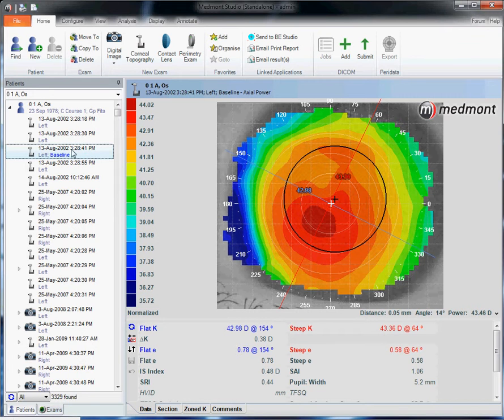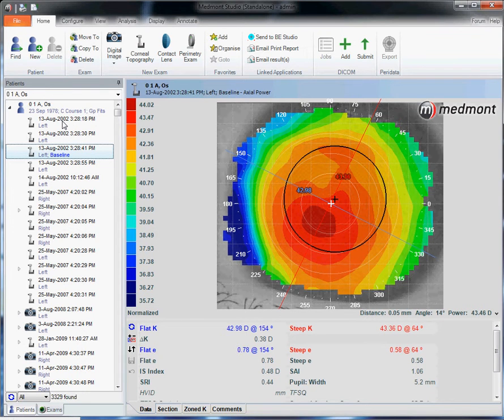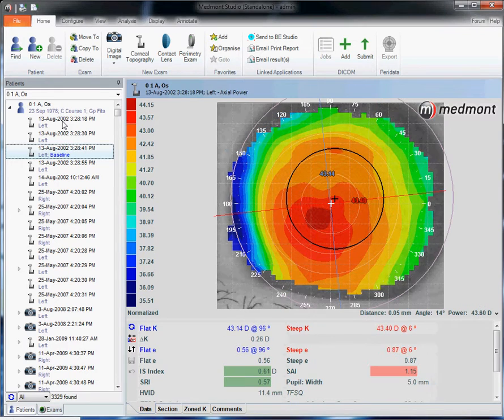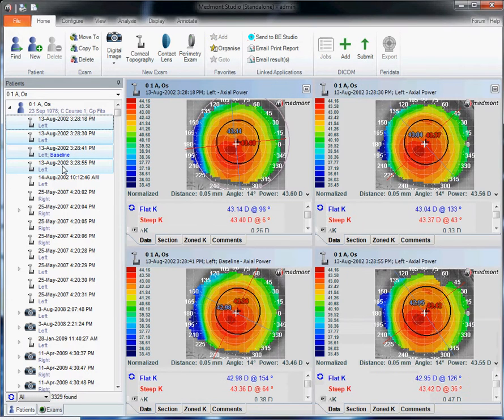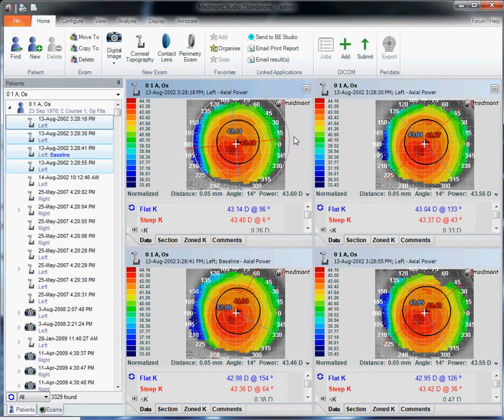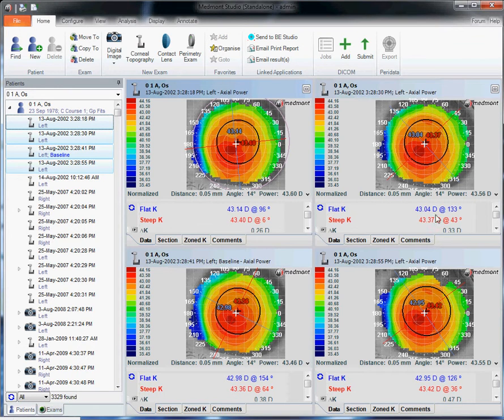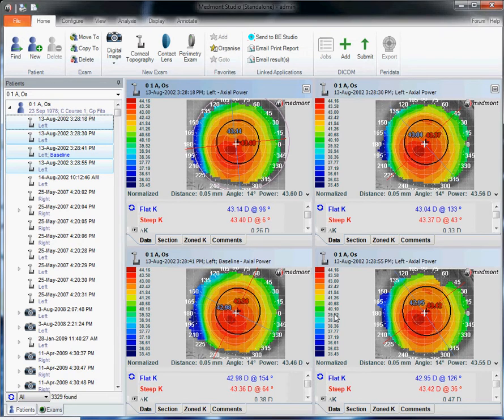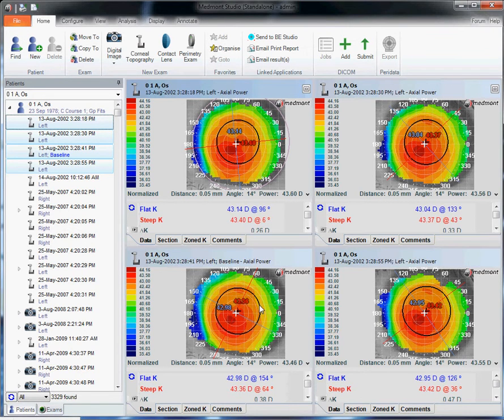If we would like to export these maps and send them off to our lab or a consultant for assistance, highlight all the maps you want to send. Make sure they're converted from the photo to a colorized topography. In other words, if your topographies have not been converted to a colorized map, the recipient will not be able to open them.